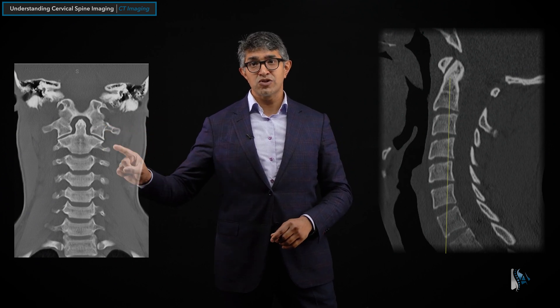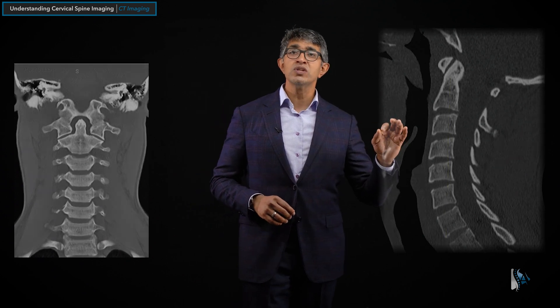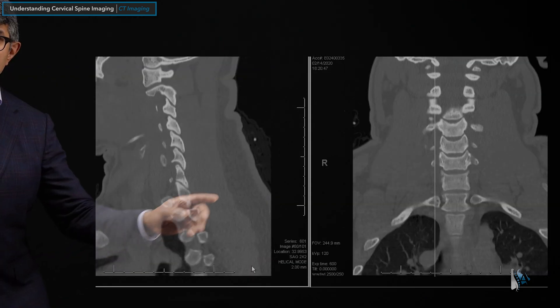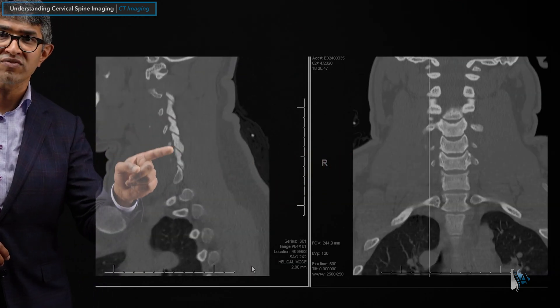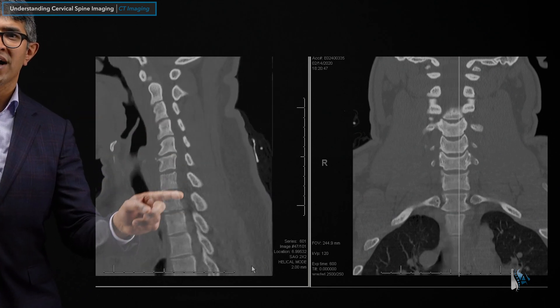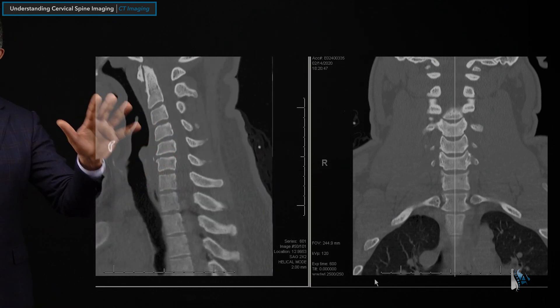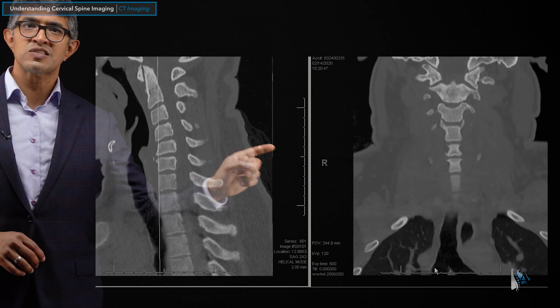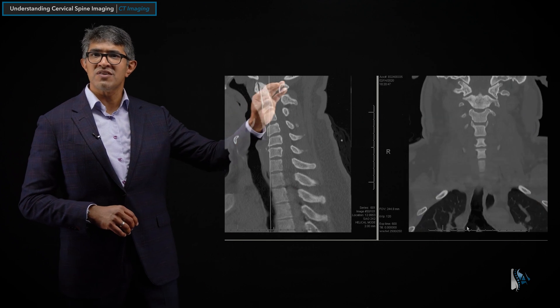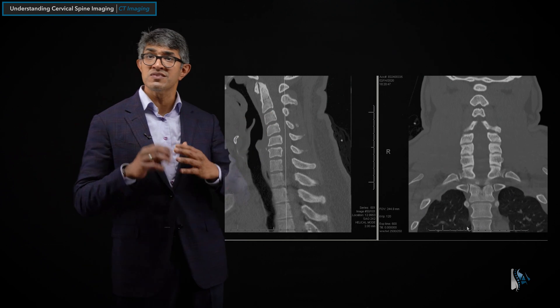Here you can see the left and right symmetry — the left would be here, the right would be there. If you work your way through a series of slices, you can see the sagittal sequences marching from right to left. You can look at the joints — these are the lateral masses we talked about. Here's the vertebral bodies, here's the spinal canal. Similarly, you can slide through coronal sequences and look at the vertebral bodies in the front, the lateral masses on the sides — really understanding what the bony anatomy looks like by stacking up all of these slices.